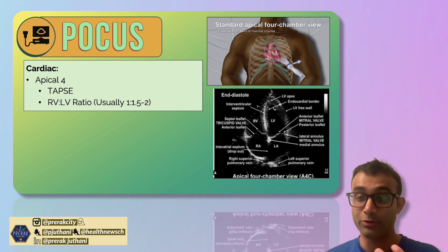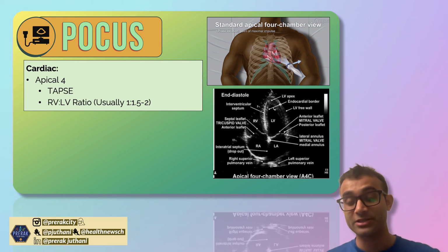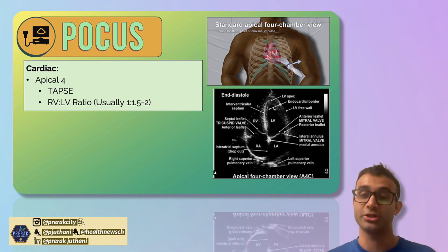The second thing that this view allows us to do is that it's also going to allow us to see how the right ventricle compares to the left ventricle.